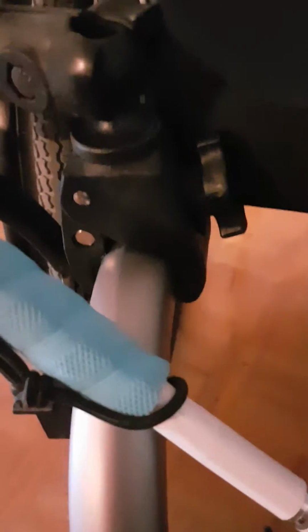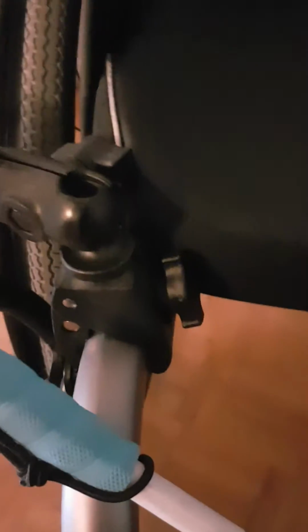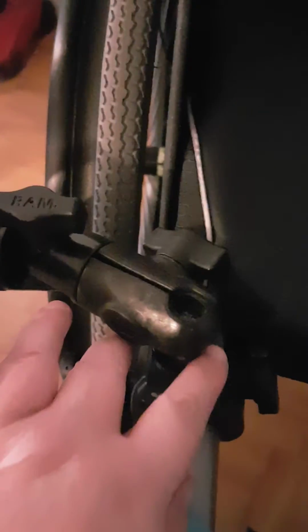And I don't know if you can see it here. Sorry guys, this is a blind person taking a video, so hope you guys can see it. So there's the Tough Claw clamp on my seat frame, and that ball at the top is hooked into the second arm of the swivel, the swivel arm. And now I'll show you the swivel arm.